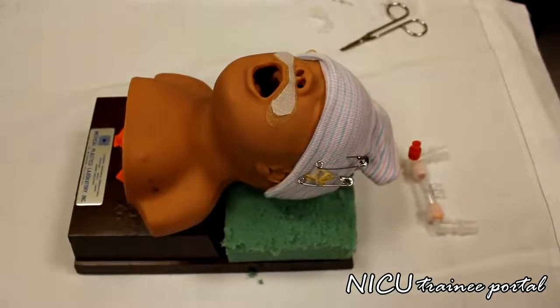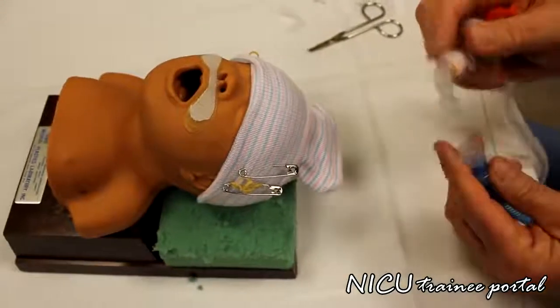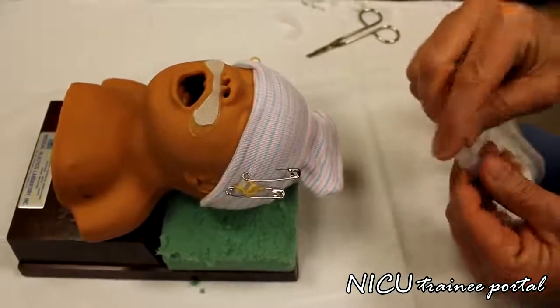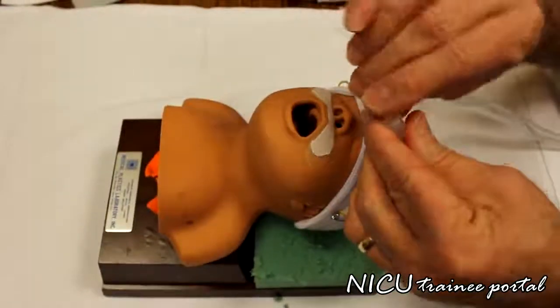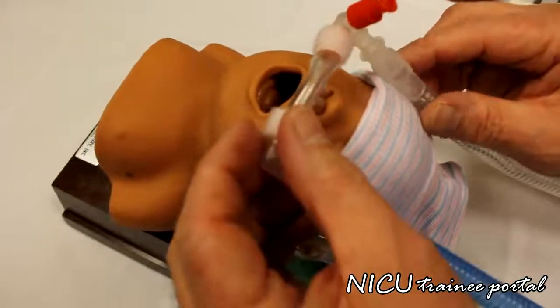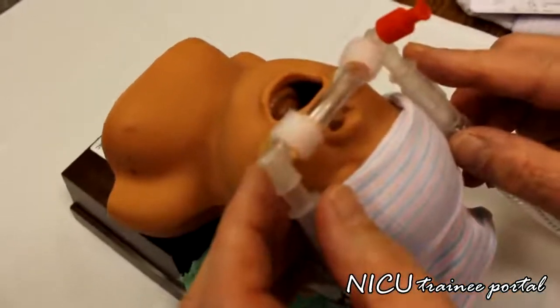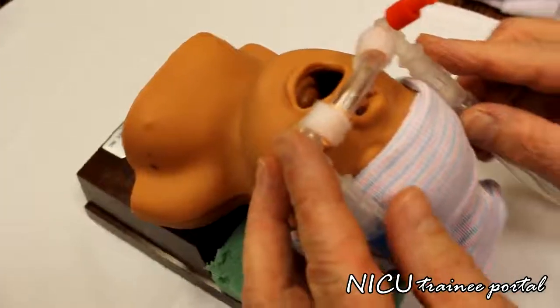Hook the ends of the CPAP setup from the humidifier. One's an inspiratory line and one's an expiratory line. And then we just place the prongs in. The prongs should be a firm fit. If you have any blanching, then the size you have is too big. You have to go down one size. These actually look pretty appropriate.